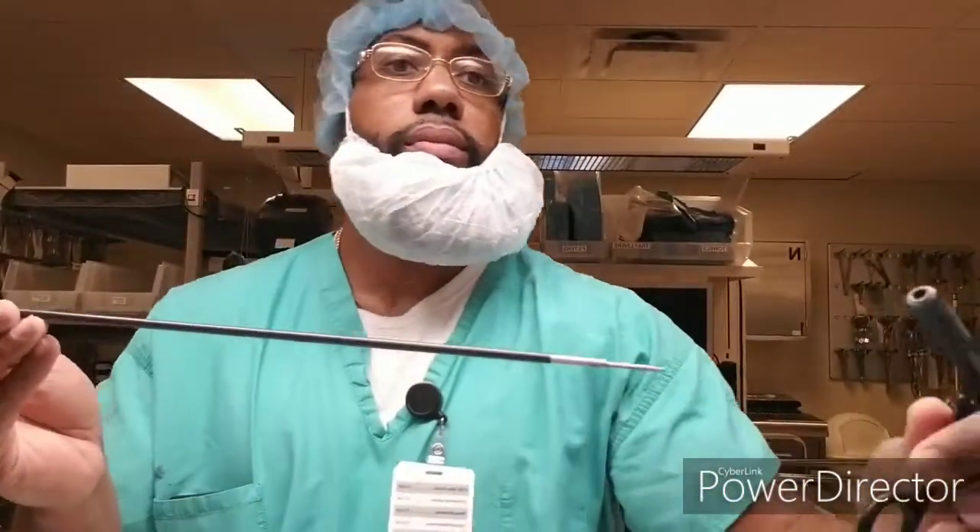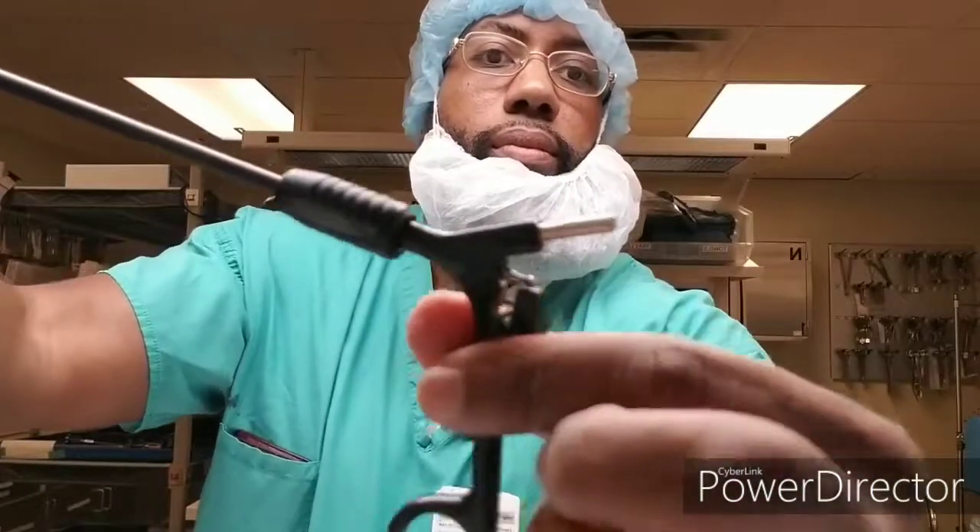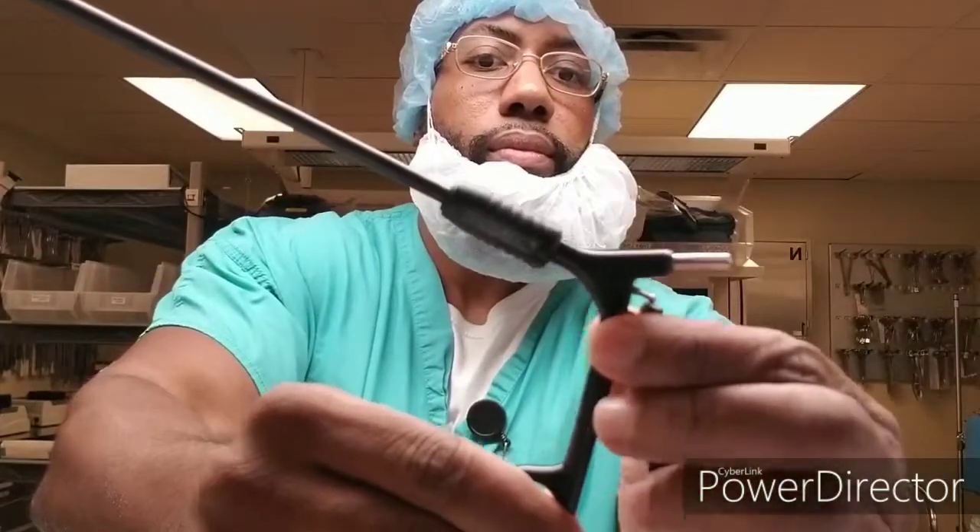There are four pieces that the laparoscopic instrument comes with: two sleeves — one inner sleeve, which is the silver piece, and one outer sleeve, which is the black five-millimeter sleeve. The last piece is the handle, which is the most important piece. There's a spring — you spring it back, it goes back and forth, snaps in, and there's a ball. You push the lever up, the handle up, and as you see, once it moves, it works.